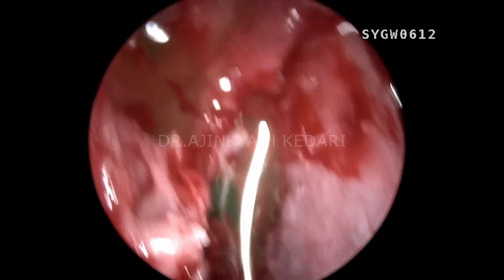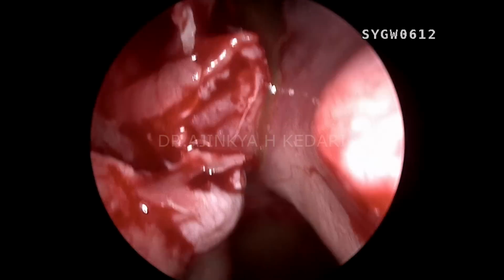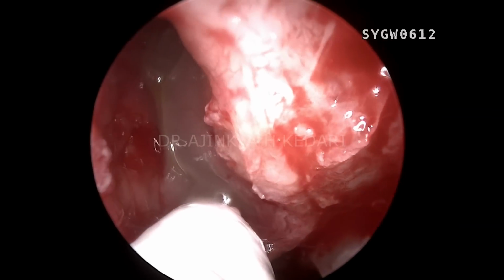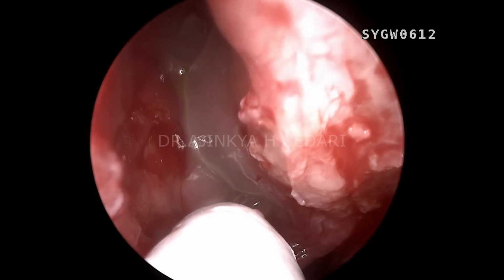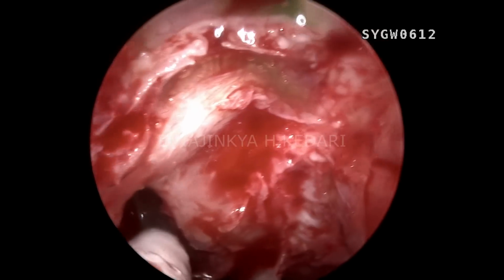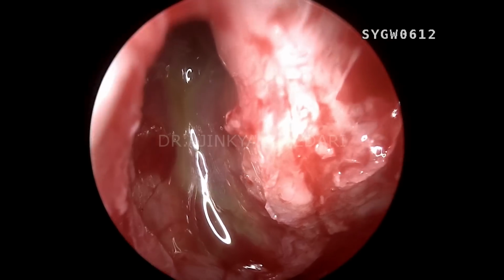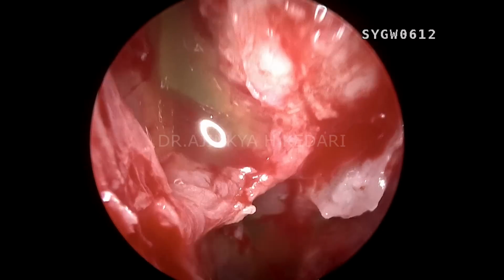If you have a doubt whether this is the same CSF just pouring from the primary site, giving a false assumption, well, that is a different site. You can see I'm suctioning it just to clear your doubts. Now you can see it's actively pulsating there and actively pouring CSF. Had it been CSF coming from the primary site, there would not have been any pulsations at the secondary site. So this is an actual secondary site for CSF leak, and that's the sphenoid down there.